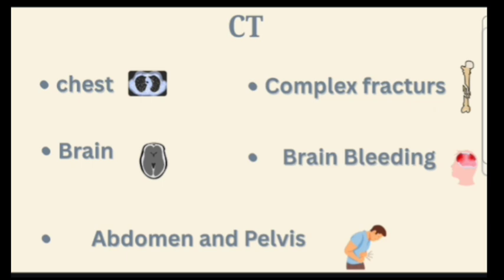It's very important in brain imaging, especially for brain bleeding, because it detects it quickly. Also for complex fractures that can't be seen on an X-ray. And we use CT for the abdomen and pelvis in emergency cases, like appendicitis.